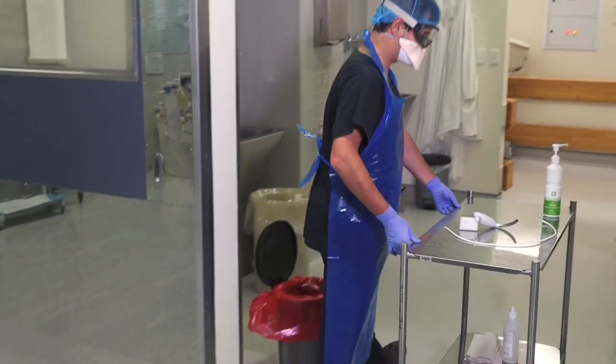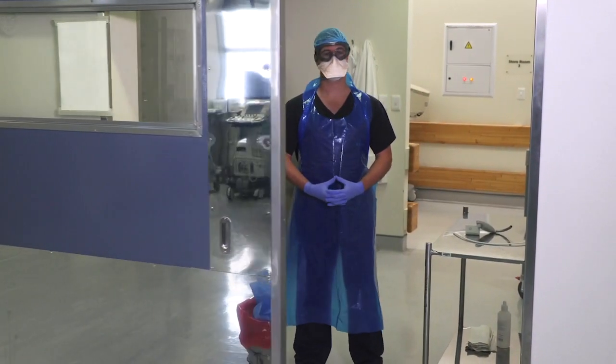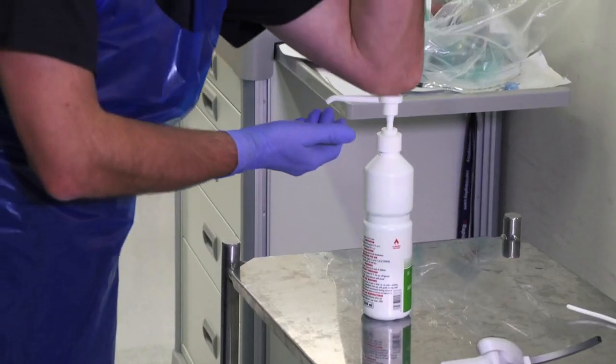Please proceed to the not hot area. Please clean your hands.